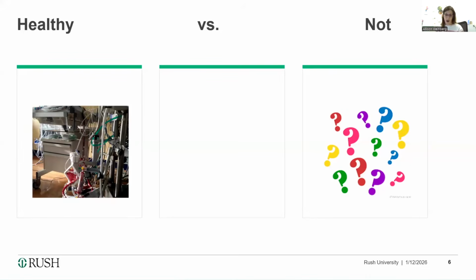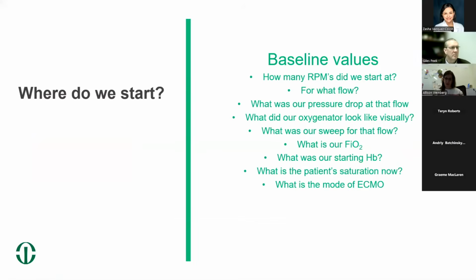That's not really why we're here today. We don't always know how to recognize or deal with what a failing oxygenator is, because it has many faces to a lot of different people. So where do we start?